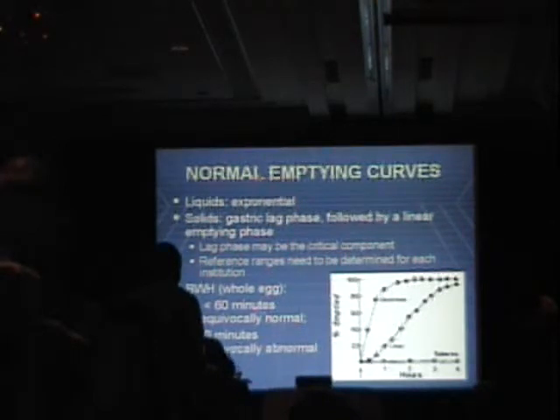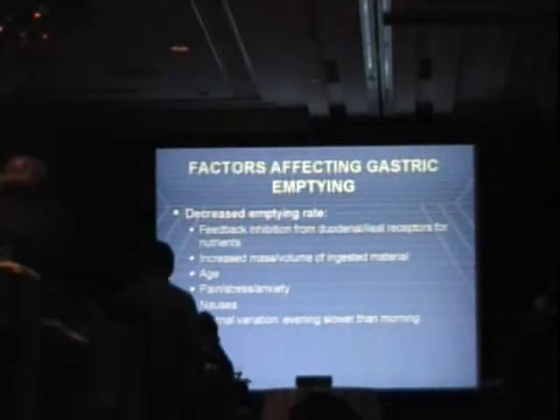For us, if it takes more than 90 minutes for the halftime of gastric emptying, we consider that an abnormal study. Less than 90 minutes is normal. Usually for patients that are really healthy, it'll be 60 minutes or less. A lot of things can affect the gastric emptying, however.